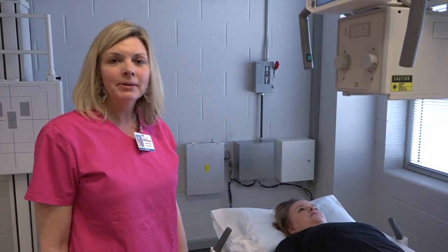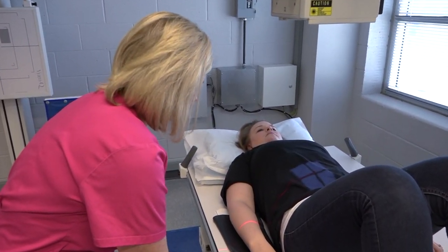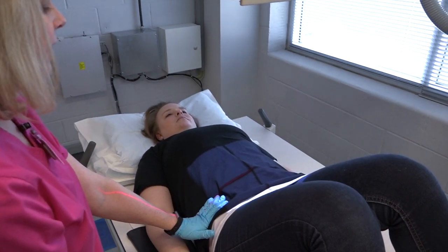Okay, our next exam is the L spine. We'll go through the AP, both obliques, the AP axial spot, the lateral, and the lateral spot. So our centering is at the iliac crest. You want to make sure that the patient bends her knees to reduce the curvature of the spine.